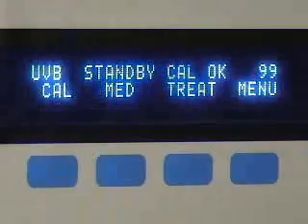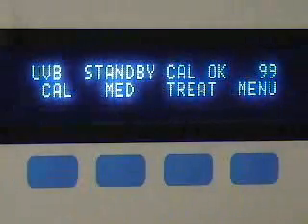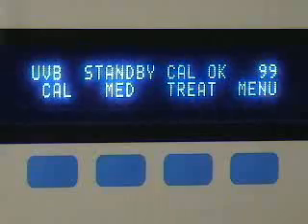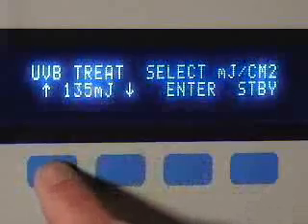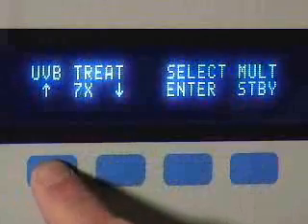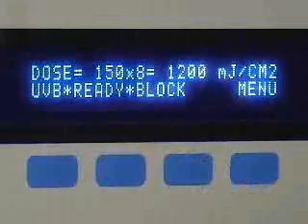Please pardon the wandering brightness of the display — this is an artifact of the videotaping process. Push-button controls allow the operator to enter whatever dose of UV light is desired. First, enter the patient's minimal erythemal dose, or MED. Then select the desired multiple of the patient's MED from 1 to 8. Thereafter, the instrument displays the total dose of UV light that will be delivered to the skin.